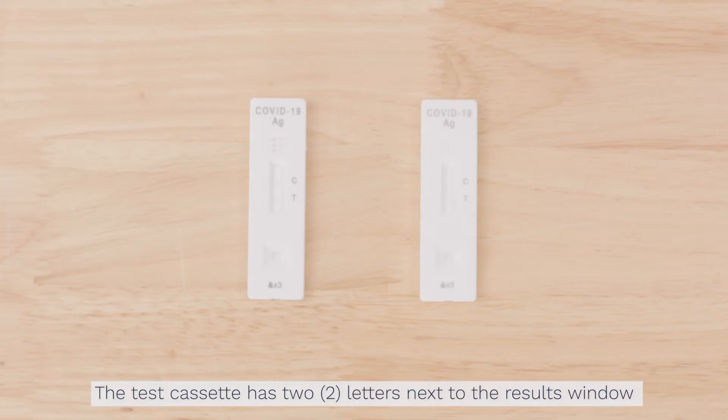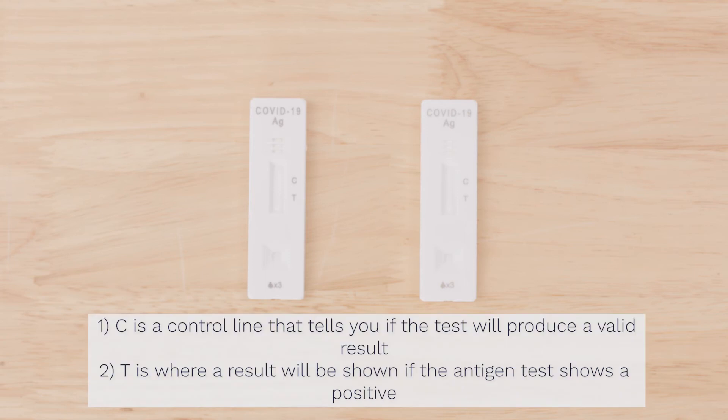The test cassette has two letters next to the results window. C is a control line that tells you if the test will produce a valid result. T is where the result will be shown if the antigen test shows a positive.